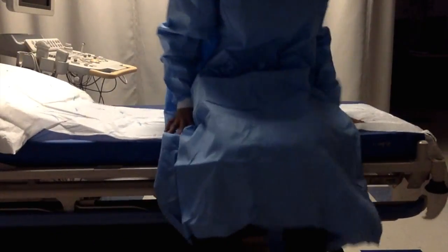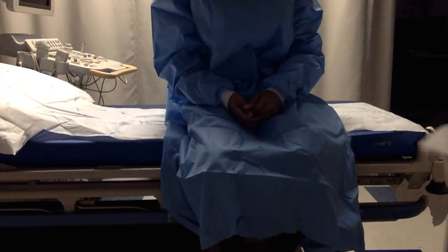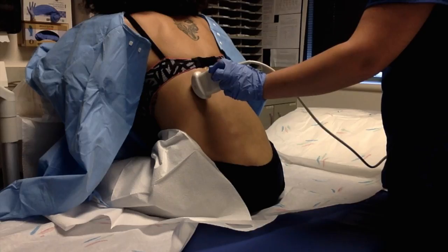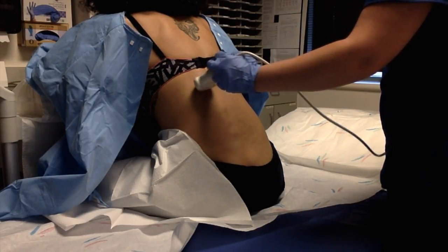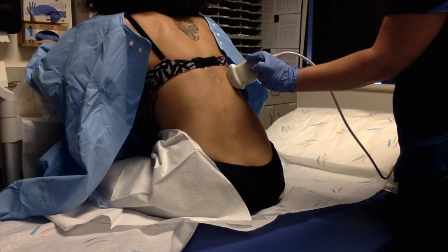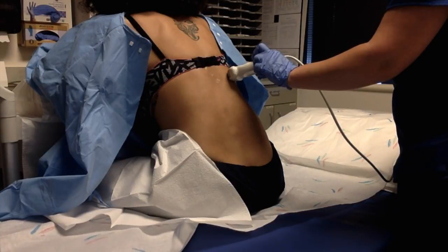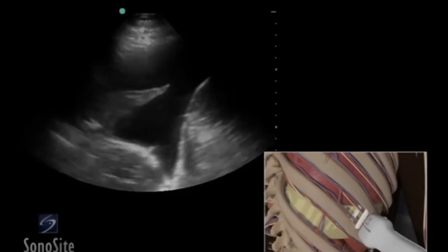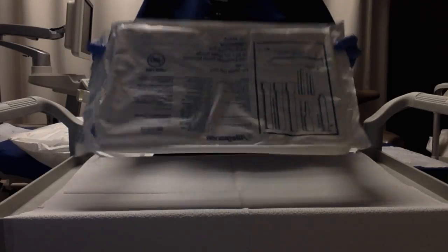A thoracentesis is very similar to a paracentesis, except it begins with the patient sitting upright while leaning over top of a table in front of them. The patient should be scanned intercostally on each side from the posterior aspect to find the largest pocket of fluid in the pleural space. The radiologist will use a puncture site 1 to 2 rib spaces below the level at which breath sounds are decreased.